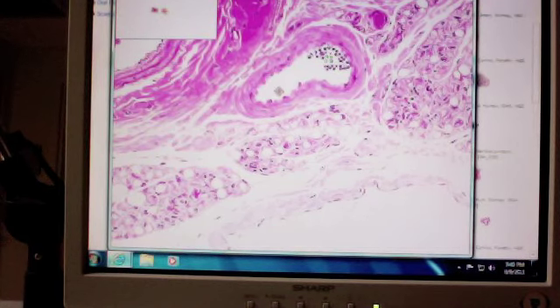And then in this case, who's my next person in line over there? If I had a pointer pointing here and I said, name the epithelium, be specific. Endothelium, okay?